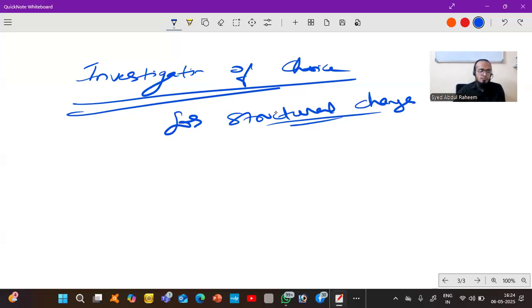If a patient has any air-containing structures, like the lungs have air-containing structures, or other spaces like the abdomen, what type of scan should be done? Basically, CT is the best option.